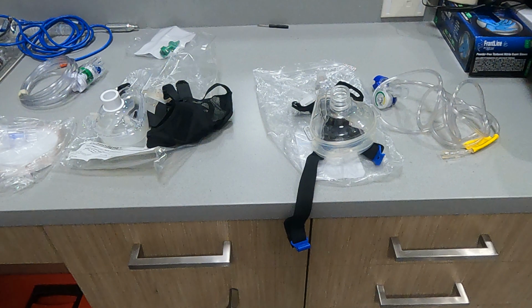It just gives them positive pressure all the time. So they need to be taking their own breaths for this to work. They need to be awake and alert so that way they can work with it and not fight against it. They need to be maintaining their own airway, otherwise this constant rushing air is going to take anything in their oral pharynx and deliver it right down into their lungs, which can give them an infection.